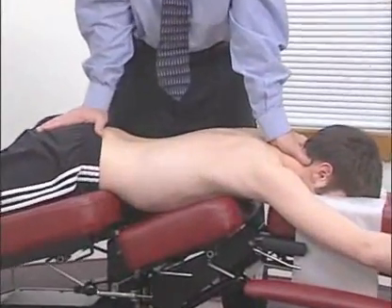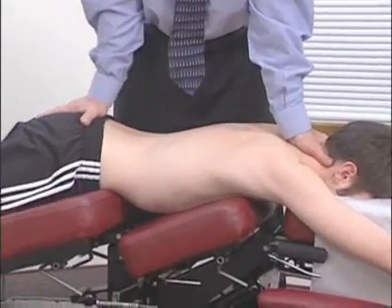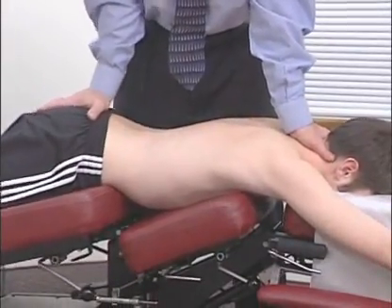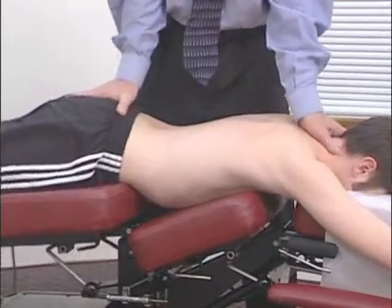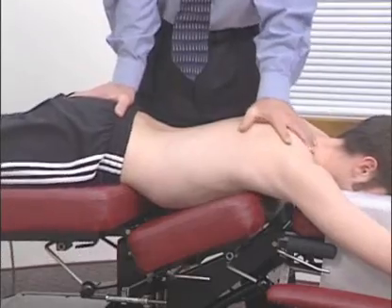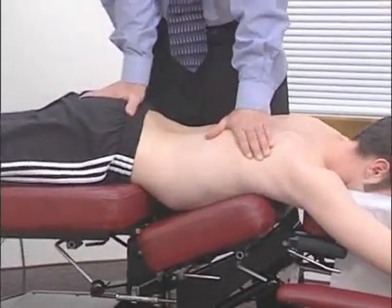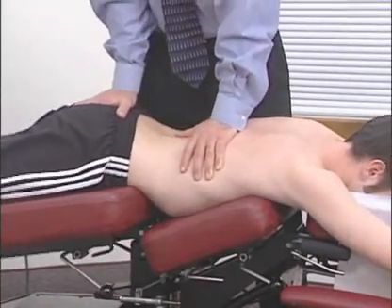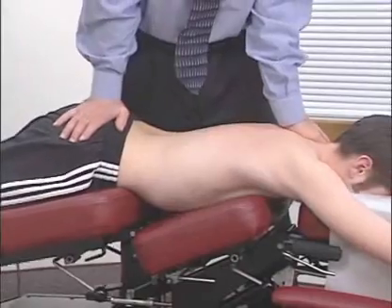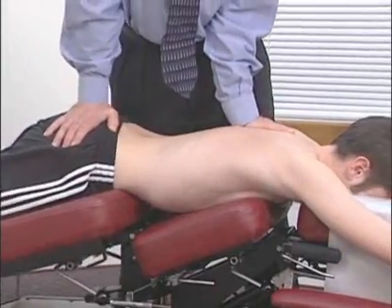Stand close to the table, elbows locked, use firm palm-hand contact. As the caudal section of the table descends, lean over the patient by rocking forward onto the balls of your feet. Use your body weight to provide stretching force rather than using your arm strength. When the caudal section of the table reaches the bottom, maintain a palm-hand contact and return to your heels. This rhythmic motion, back and forth, expends little energy while providing significant stretching force.